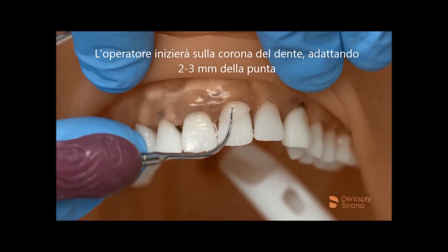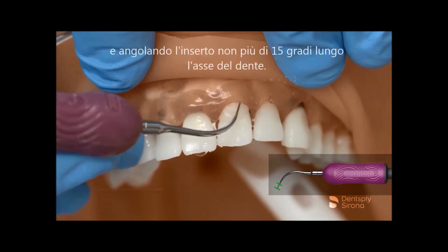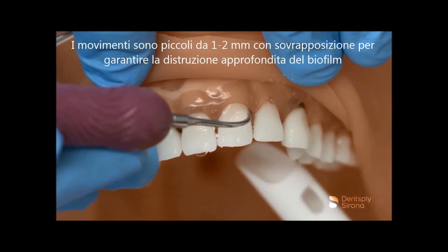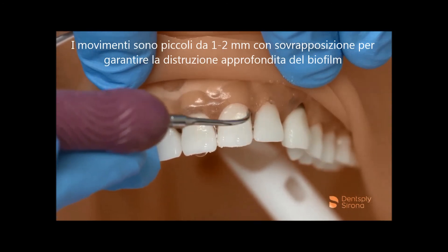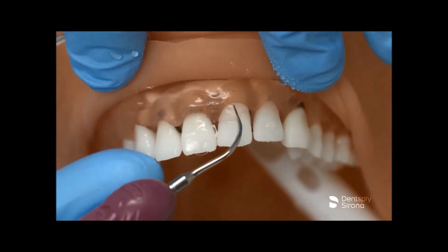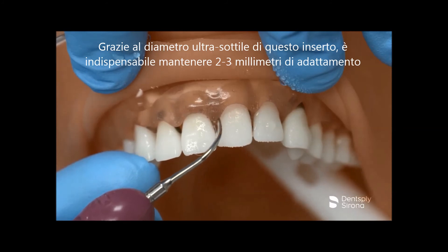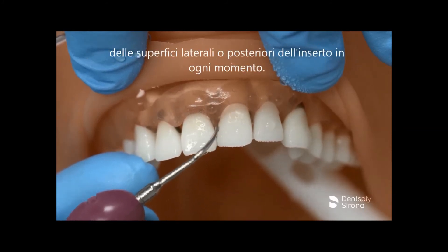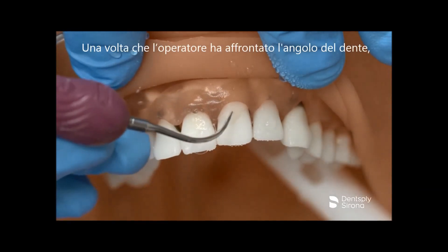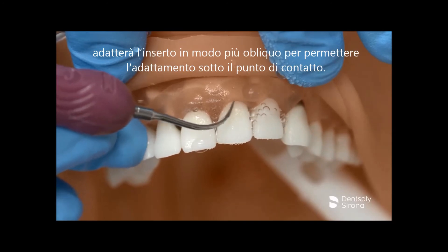The clinician will begin on the clinical crown, mindfully adapting 2-3 mm and angulating the insert no more than 15 degrees to the long axis of the tooth. The strokes are small, 1-2 mm overlapping, to ensure thorough debridement of the biofilm and any ledge deposits. Due to the ultra-thin diameter of this insert, it is imperative to maintain 2-3 mm adaptation of the lateral and/or back surfaces of the insert at all times. Once the clinician has approached the line angle, the clinician will adapt more obliquely to allow adaptation under the contact.